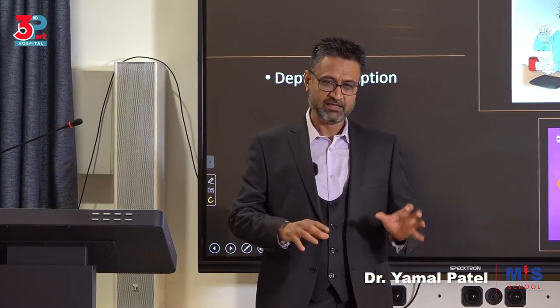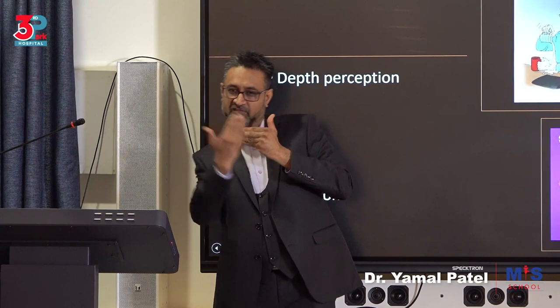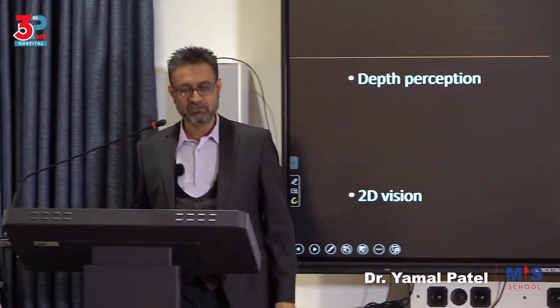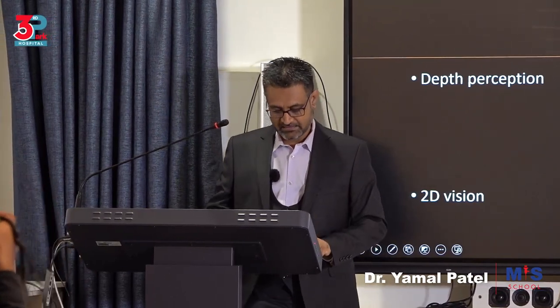So how to convert this 3D view that you are used to when you're doing open surgery into a 2D screen view, where you can't see depth that clearly, where you don't know which structure is behind which in a proper way, it's all laid out on one screen, you'll have to practice and learn that.